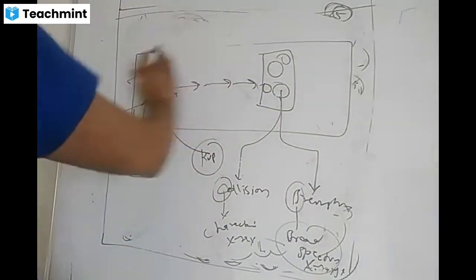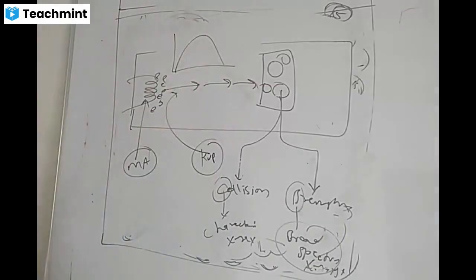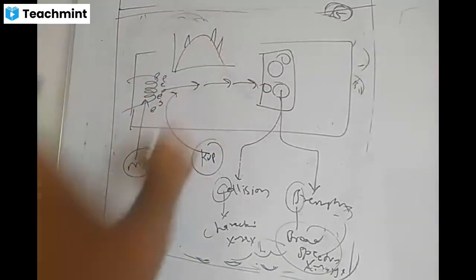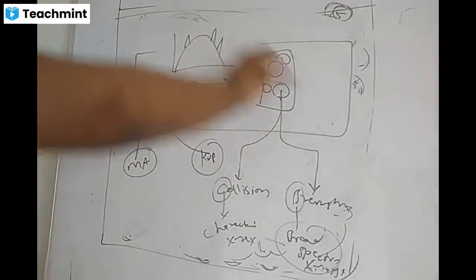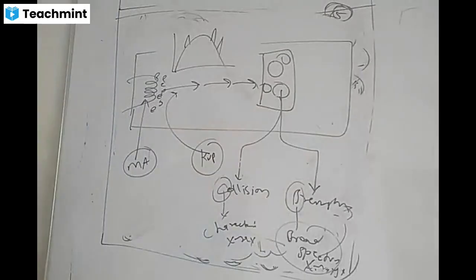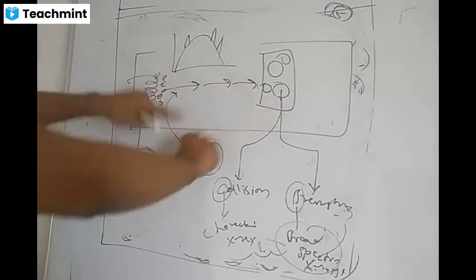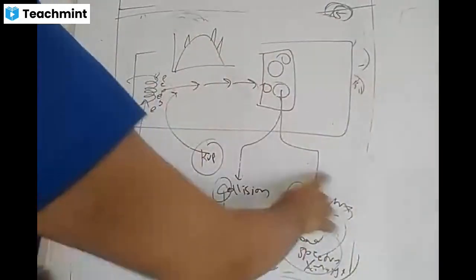And if you make one simple graph, the graph will be like this. That is a broad spectrum with some peaks. And these peaks are nothing but characteristic X-ray. So a lot of MCQs in this portion. First MCQ, quantity with the MA, quality KVP. Next MCQ, major mechanism, Brem.